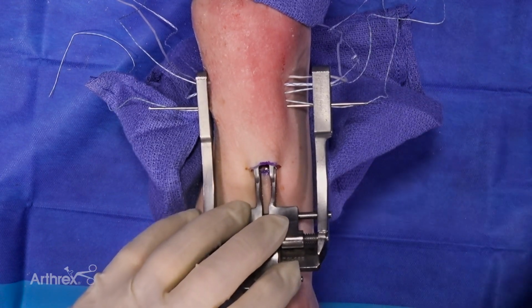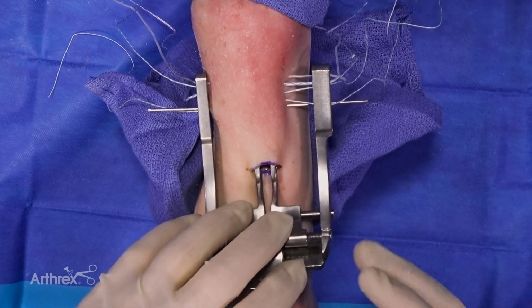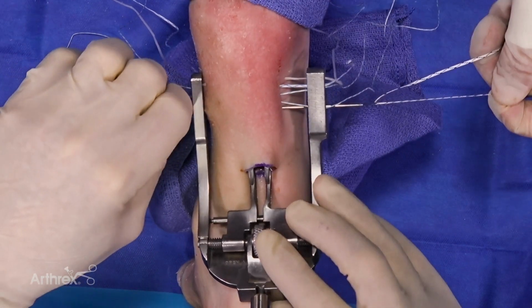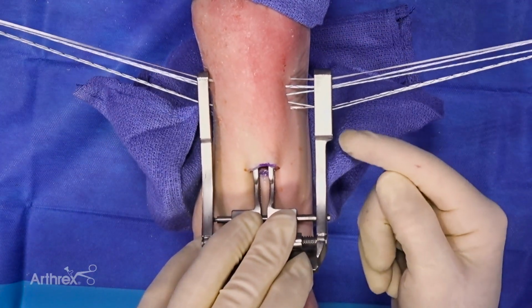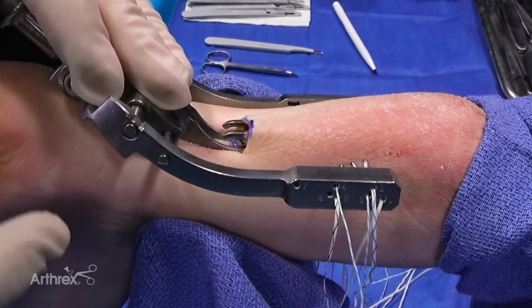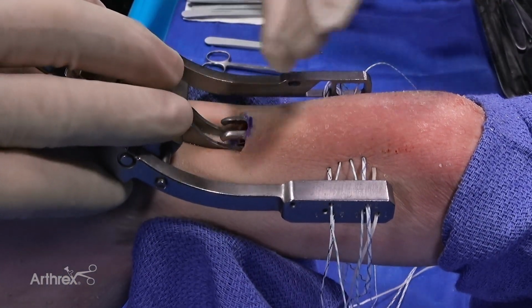that 5th suture. So now our 5th suture, this is what we call our zebra suture. It's a black-white stripe. Again, it's a SutureTape suture material, and we're going to draw that through, and then now we have our apparatus. You'll see on the device there's also a position 6 and 7. I'll turn that so you can see that right there. Position 6 and 7. That's if you want to double lock on this side of the rupture.